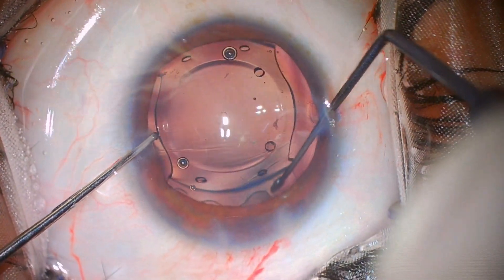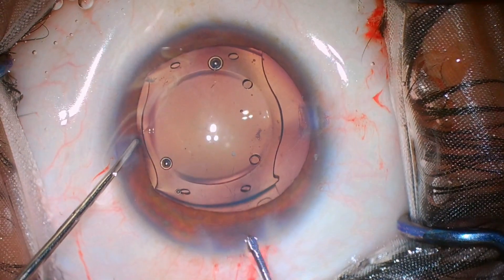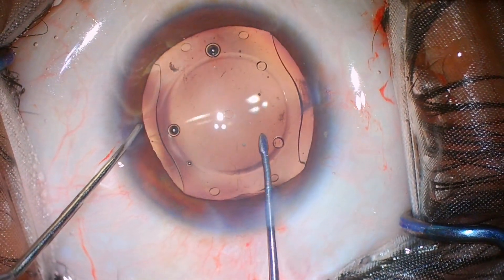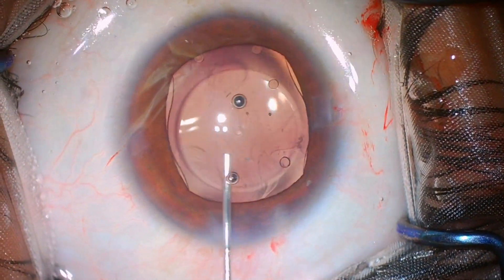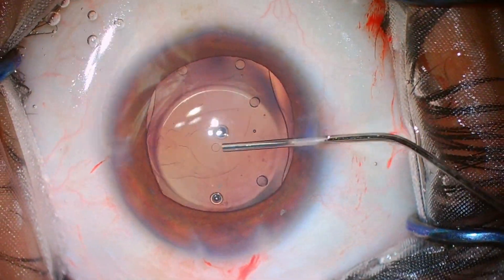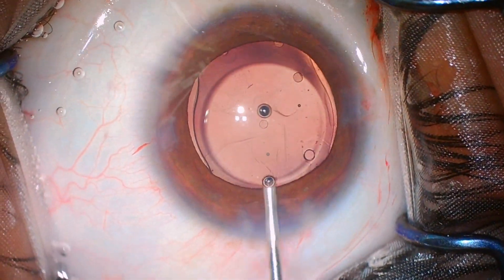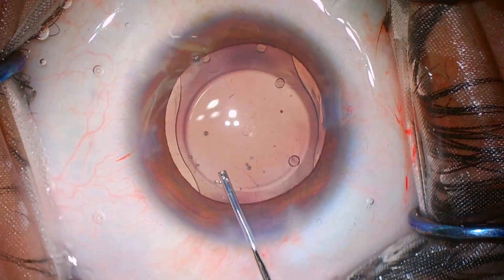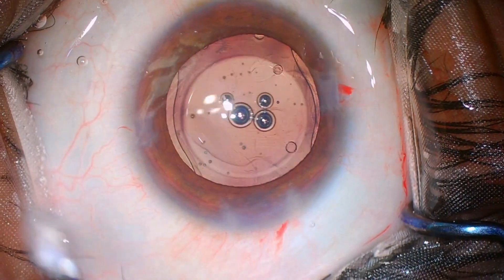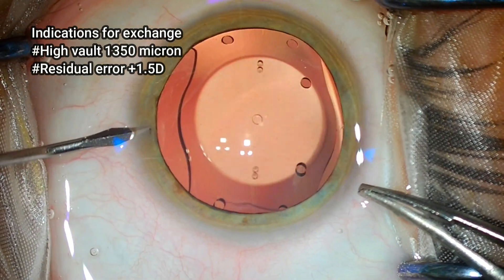But irrespective of how many phakic IOLs you do, you may find that 1 in 100 cases there might be a mismatch. Because we measure the diameter or length of the IPCL based on the white-to-white diameter, and sometimes there is a discrepancy between the sulcus-to-sulcus diameter and the white-to-white. So you may still need to exchange occasionally. Also, when pushing the IPCL inside, it might open up reversed — though this happens very occasionally, maybe once in 100 cases. Just make sure the nozzle of the injector is right inside and you are not doing wound-assisted injection. In this case, I rotated the nozzle by mistake, which led to a reversed IPCL. But it's very easy to just remove it and re-inject.